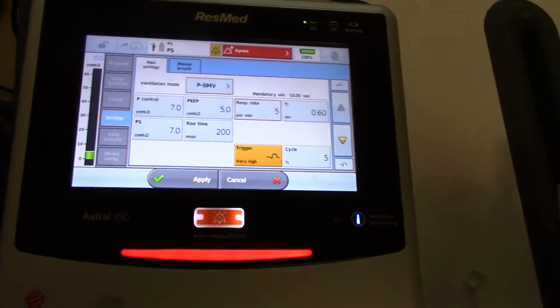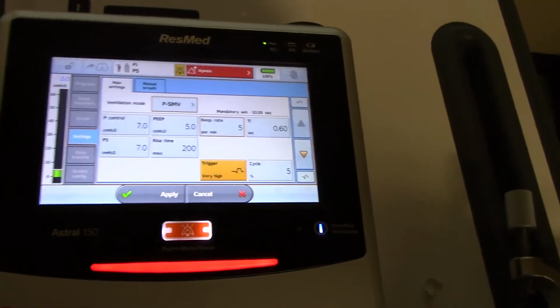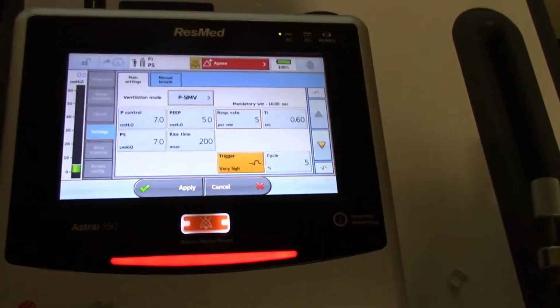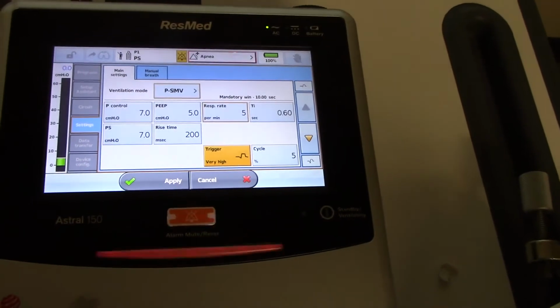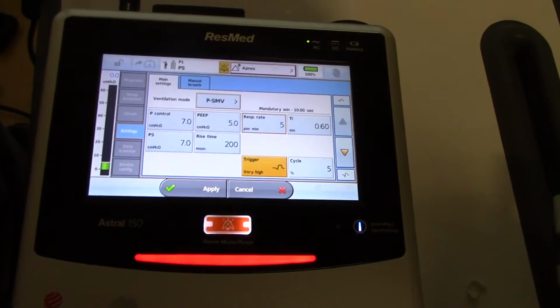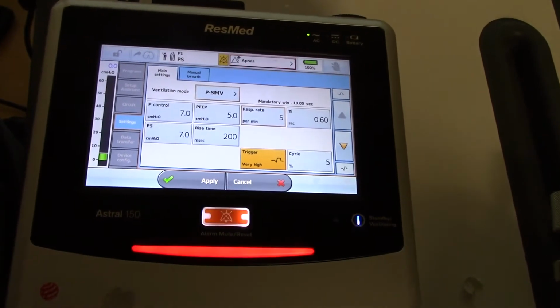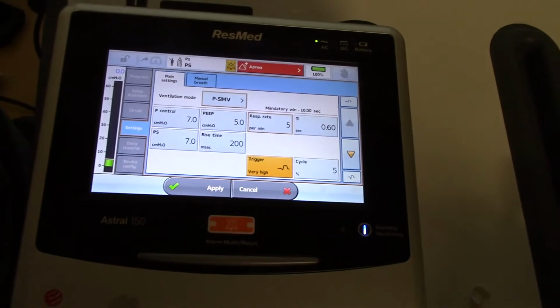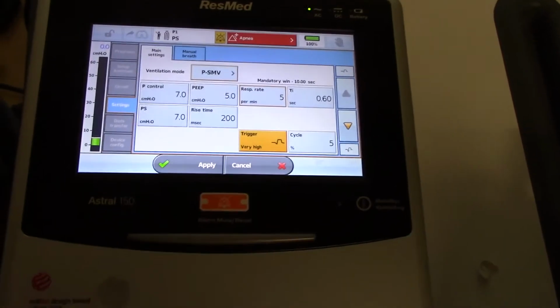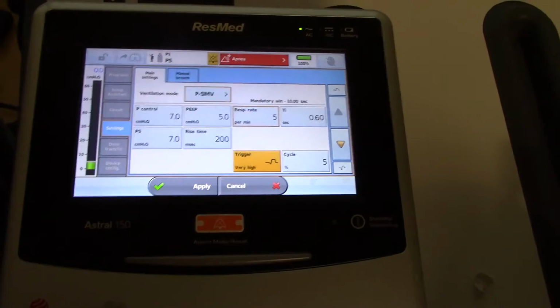Now, what I'm going to say about this is this vent is definitely not as sensitive to the trigger as the servo is. So you probably want to start on very high, and then if the patient still is not triggering any of the pressure support breaths, then you want to look at getting rid of any dead space in the circuit that you're able to get rid of with the physician, i.e. anything in front of the Y. So that would be your end-tidal monitor, your inline suction catheter, or your Omniflex. Those are basically all we usually have on patients that we could get rid of to help the triggering mechanism.